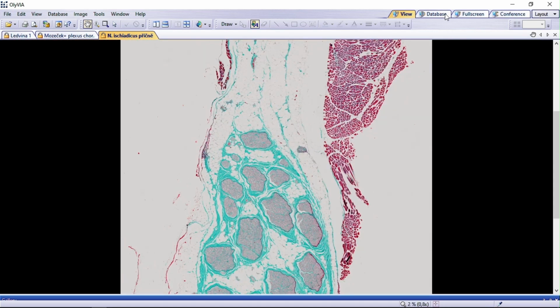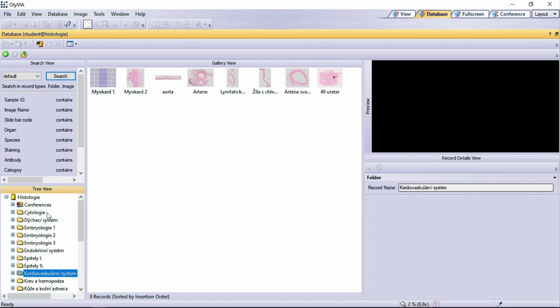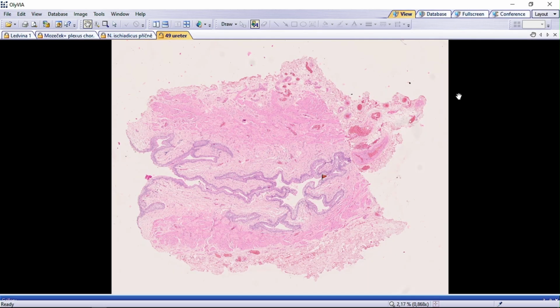There might be some specimens with some flags. I don't know, this one for example, the flags have been placed by the senior teacher, Dr. Kamarat, from Czech language, Dr. Friend, which is also a paradox.